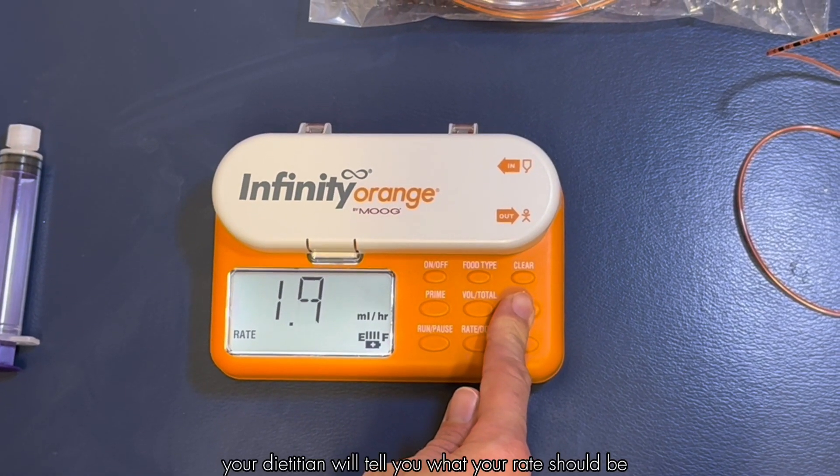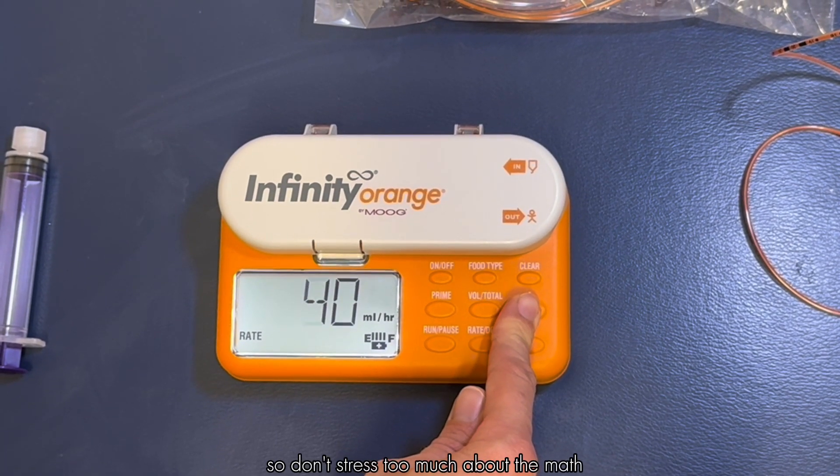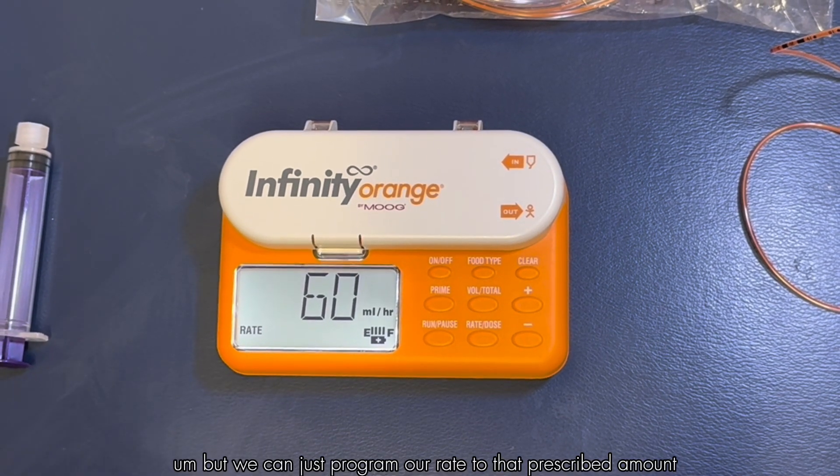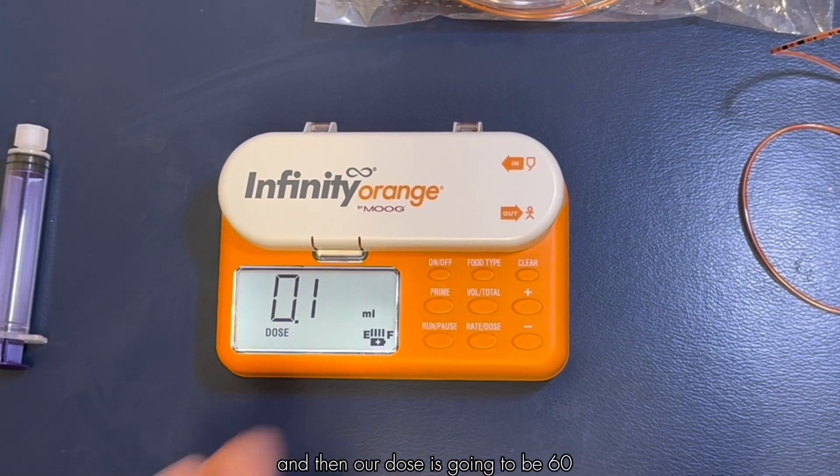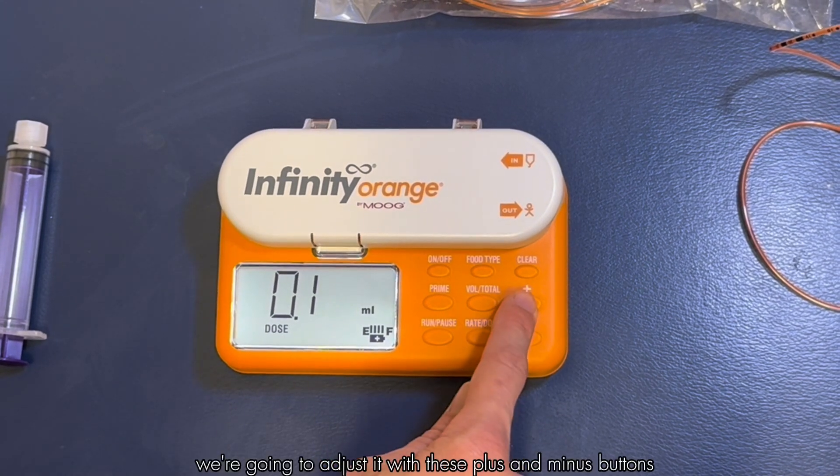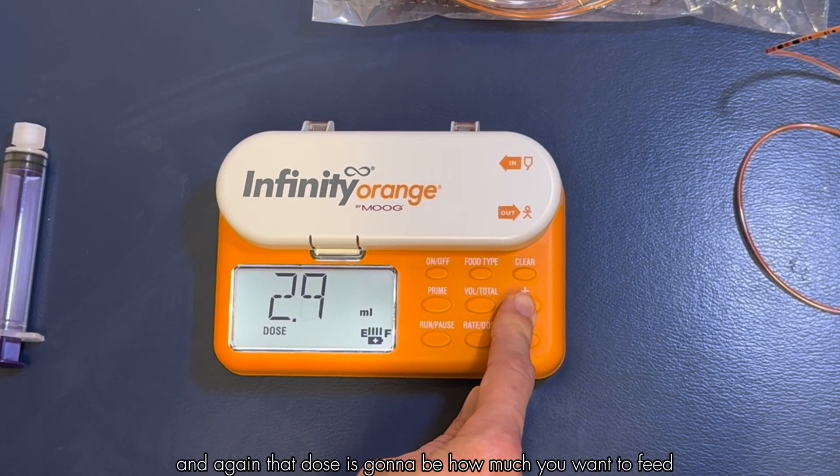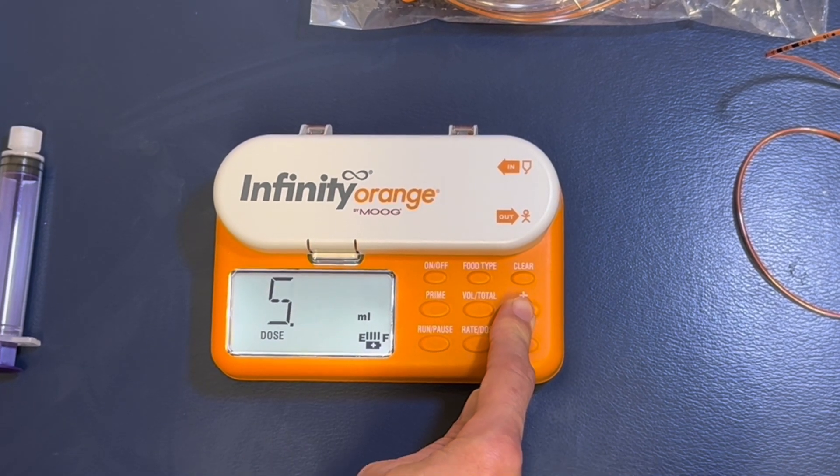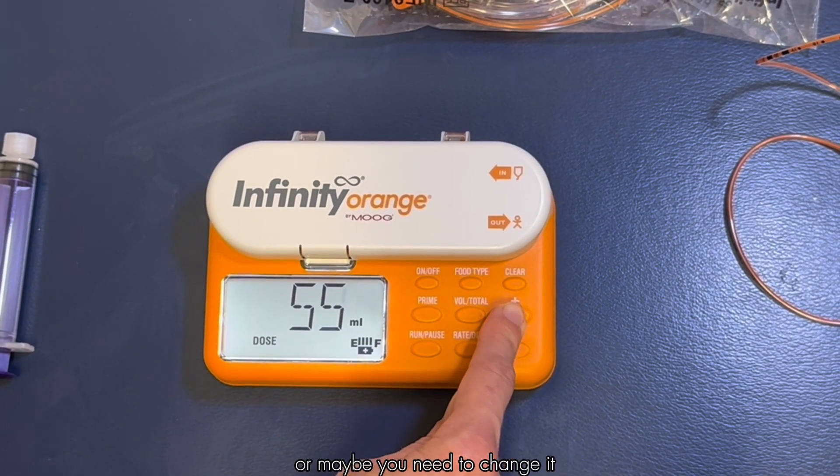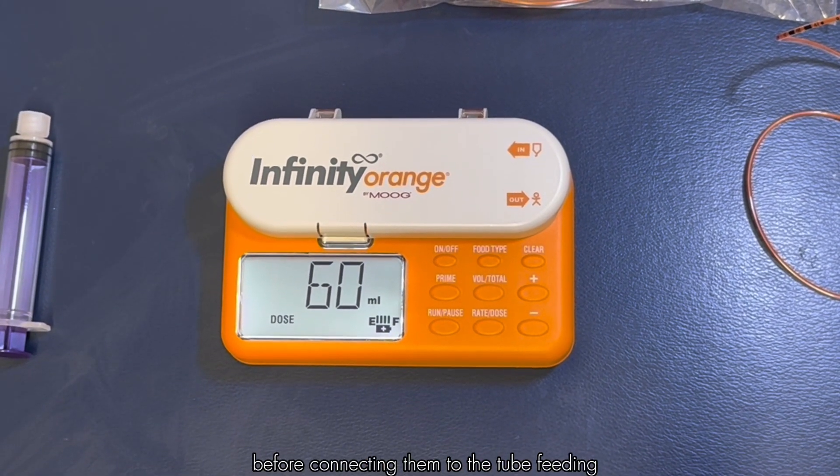Your dietician will tell you what your rate should be so don't stress too much about the math, but we can just program our rate to that prescribed amount and then our dose is going to be 60. We're going to adjust it with these plus and minus buttons. The dose is how much you want to feed and it might be that the dose is the same every time or maybe you need to change it depending on how much your child took by mouth before connecting them to the tube feeding.